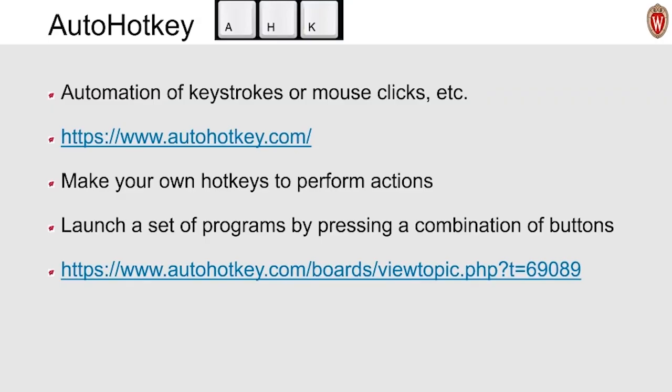AutoHotkey. AutoHotkey makes my life easier. It's just that simple. When I want to do a review of my QTOF data, I need a bunch of things open and I like them spaced out in a certain way. So I adapted a script I found on their forum to meet my needs. When I'm at work, that layout's different than when I'm working remotely, so I adapted it further. This saves me from opening each program separately and moving the windows around, all in one quick program launch.